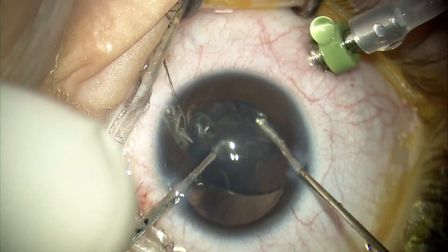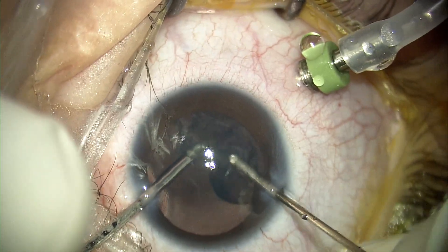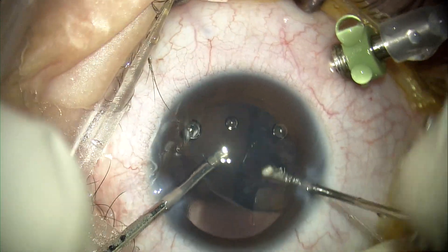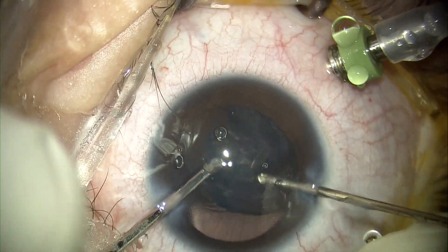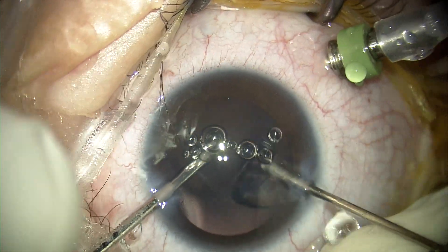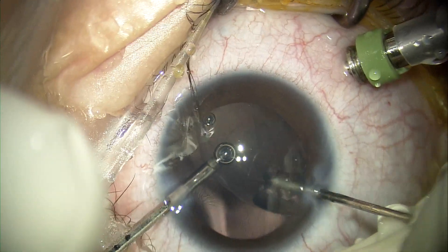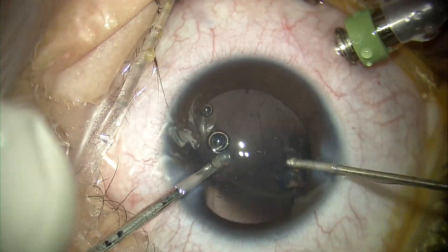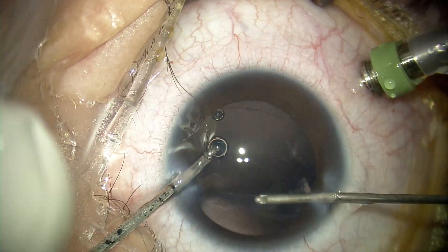I tried as much as possible to preserve the anterior hyaloid face and not to disturb it. Sometimes it is impossible. As you can see, I have the infusion cannula placed in the pars plana in anticipation — if I have vitreous loss and the eye becomes hypotensive, I can always switch it on in order to reform the globe. Now that all the lens matter is removed, I will remove the posterior capsule.